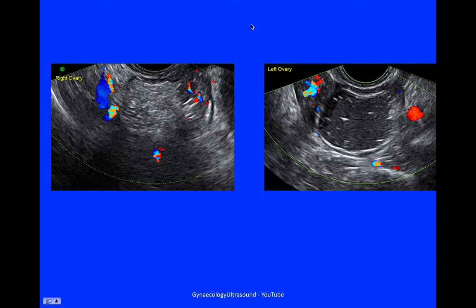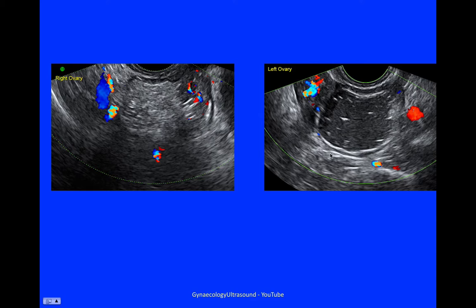This patient had bilateral dermoids. The right ovary was a 50mm lesion — it was unilocular with mixed echogenicity. And on the left, it was 46mm, again unilocular with mixed echogenicity, shadowing, and no flow.